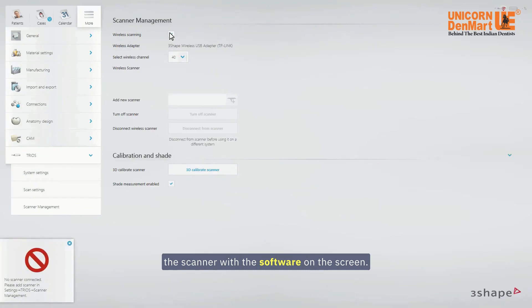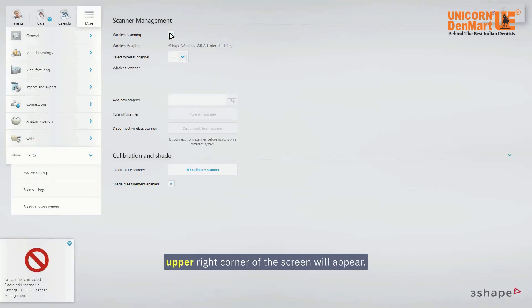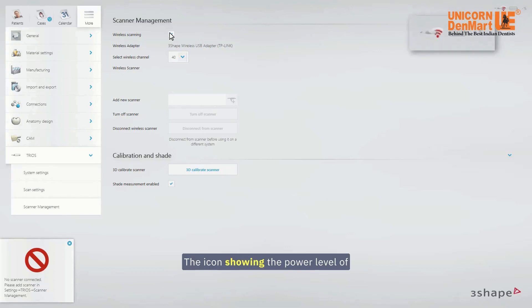On the screen, you will notice that the scanner status in the upper right corner of the screen will appear. The icon showing the power level of the battery in the scanner becomes visible.